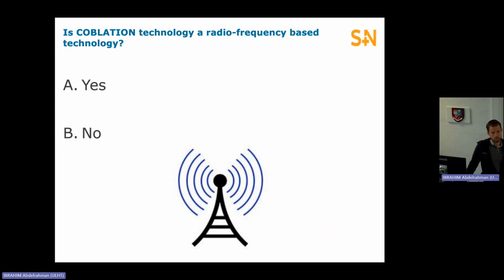Do we still think that it's a radio frequency technology? No? Okay. It actually is a radio frequency technology. It is like your bipolar machines or any diathermy machines you use, but it's just much lower in energy. So the voltages, waveforms and frequencies used within the blue box, which we'll see later, are just much lower. But it's still radio frequency.